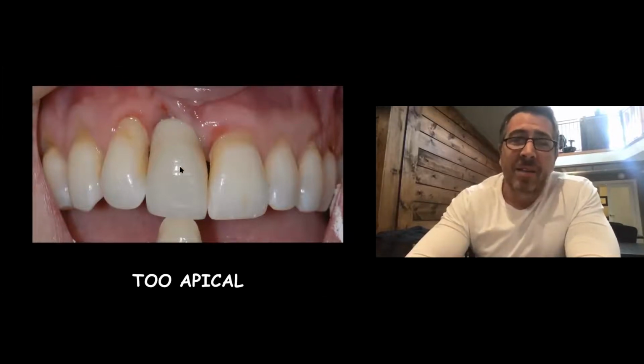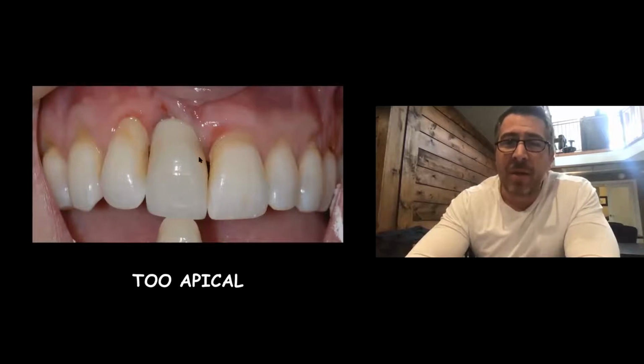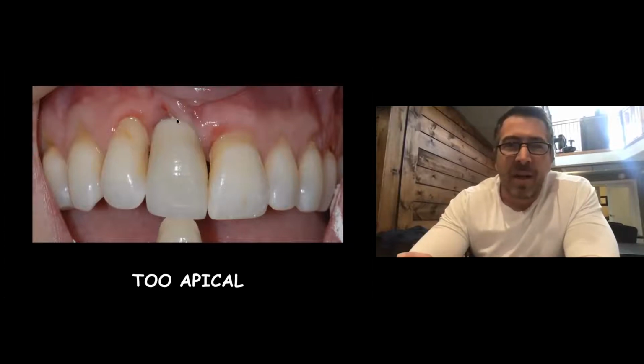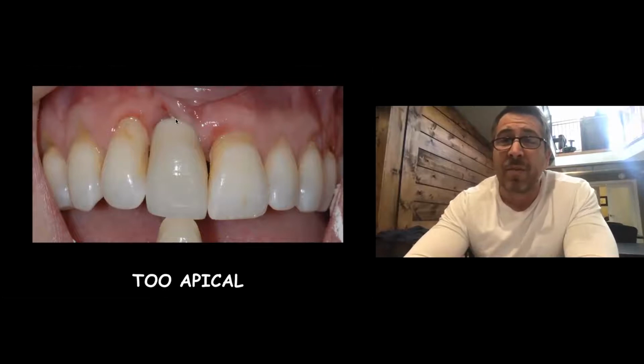So now we have to ask our lab to become a little bit better with their ceramics, maybe make this look like a root, like this adjacent tooth does. So yeah, all these teeth are ugly. He's got one more ugly tooth in there. But the point is, knowing that the shoulder was going to end up where it was going to end up because of where the vertical bone was.